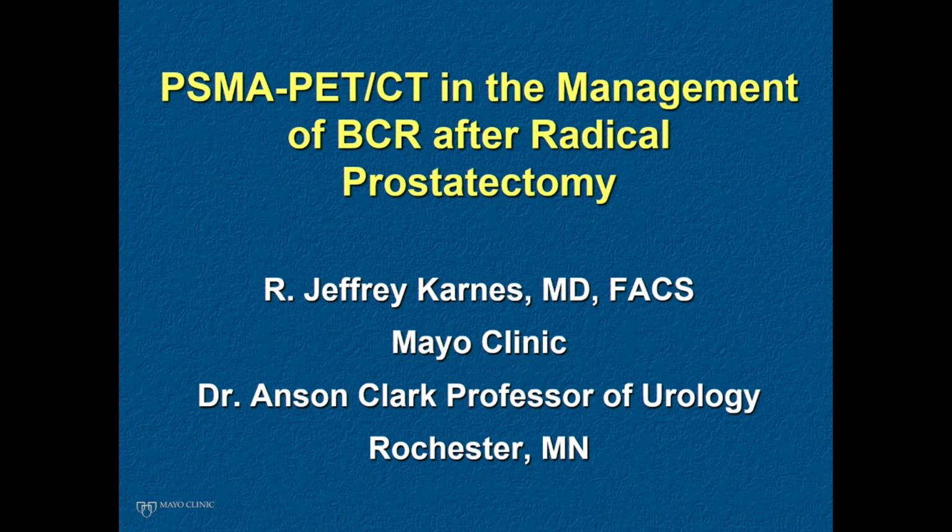From there, when I get that lesion, I usually do it in our multi-tumor board, our multi-D discussion, where we really review the imaging. Do we think it's real? Do we need a biopsy? Really patient-focused, patient-centric discussions, and discuss with the patient what they want. And then, if everyone agrees, in a young, healthy patient, I would generally proceed with localized therapy.